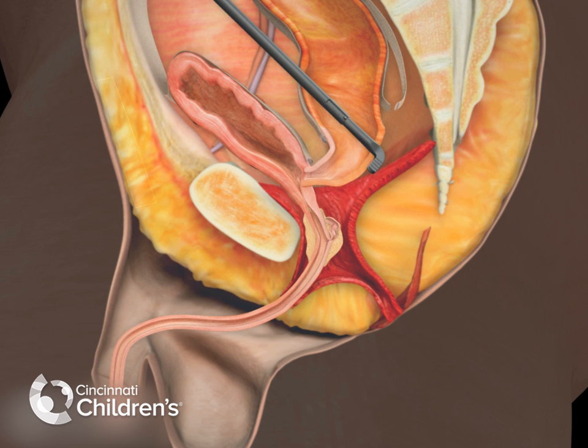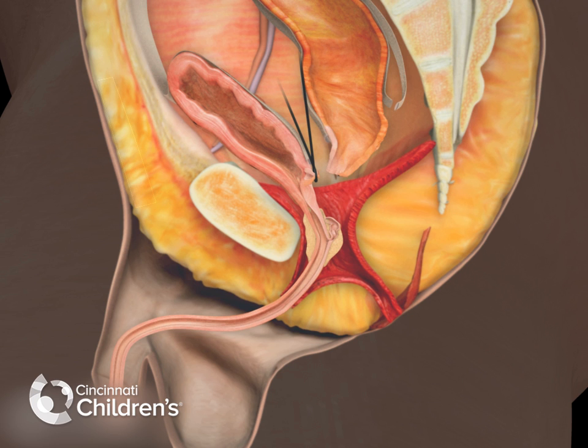Once the fistula has been completely dissected, a ligature is passed around the fistula to secure the bladder side and the bowel is divided, removing the rectum from the bladder neck.